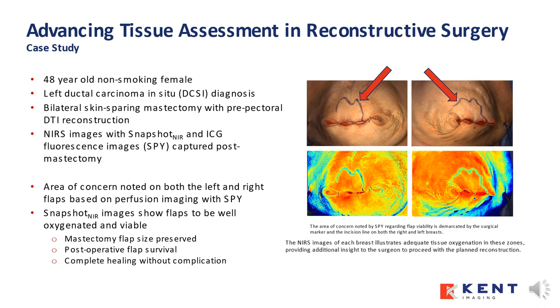SnapshotNIR plays a critical role in guiding real-time decision-making. In this specific case, having the timely information that the flaps were well oxygenated and viable was a key factor in the decision to proceed with a direct-to-implant reconstruction.